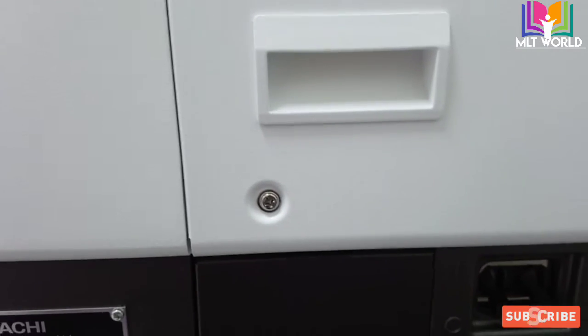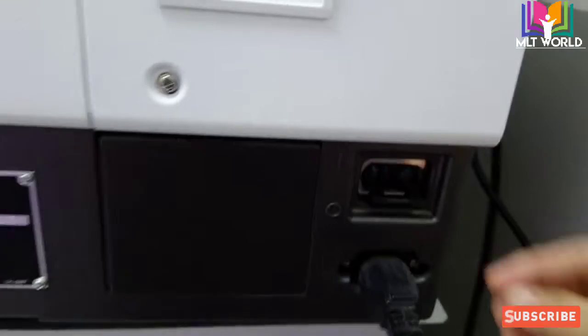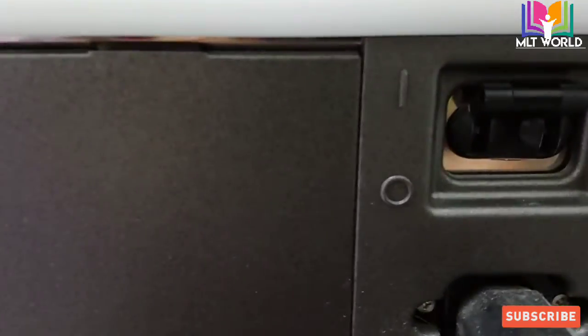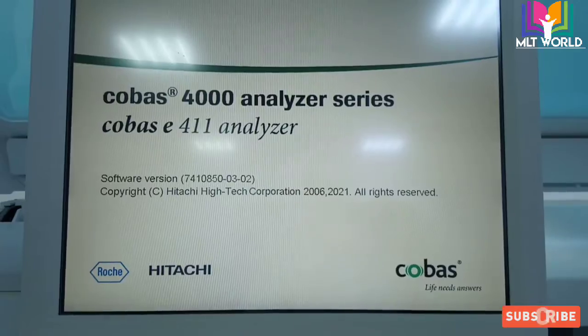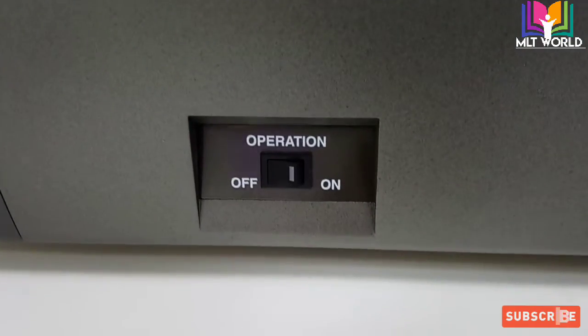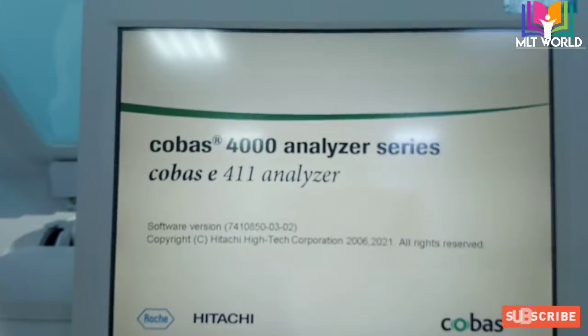First we will turn on the machine. The power button is on the right side at the back of the machine. We just pull it up and the machine will turn on. When we press this button, we will wait for the screen to come on fully. When the screen is on, it will show that the front switch button is off.